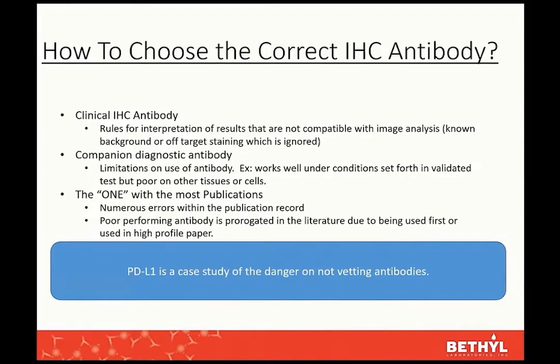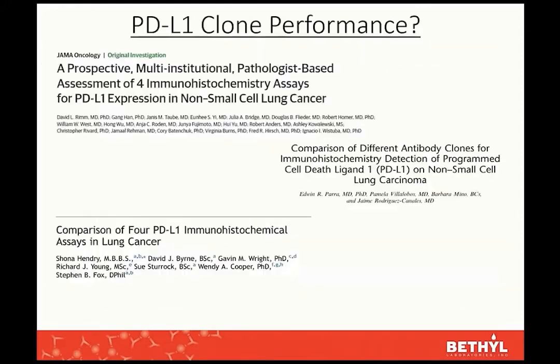And I want to use PD-L1 as a case study of the danger in not vetting your antibodies in-house and making sure that you've chosen the best antibody. Over the past several years, there have been multiple research papers published that compare different PD-L1 clones and their performance within IHC assays.